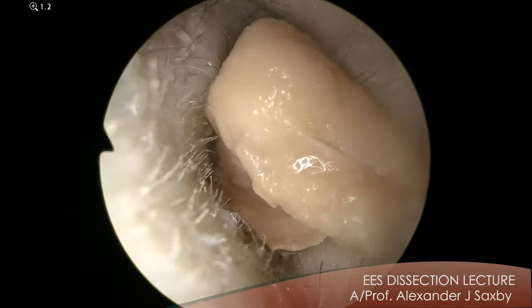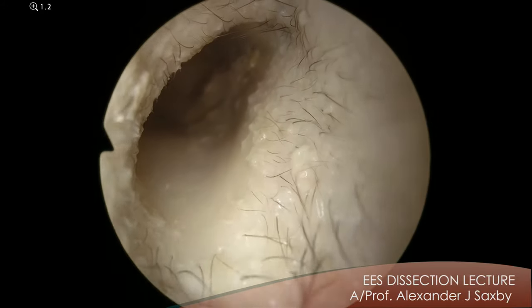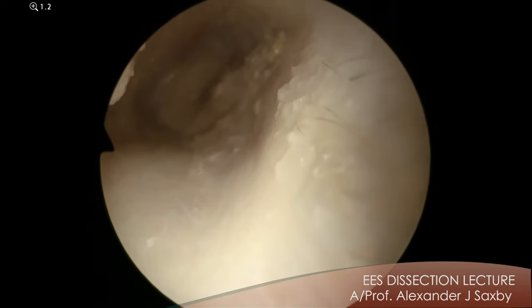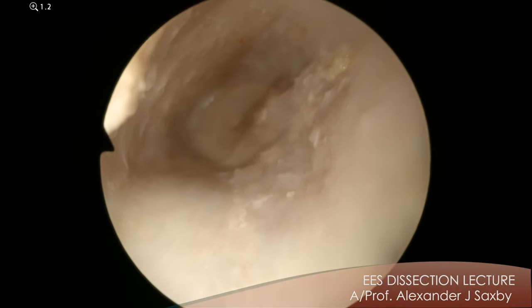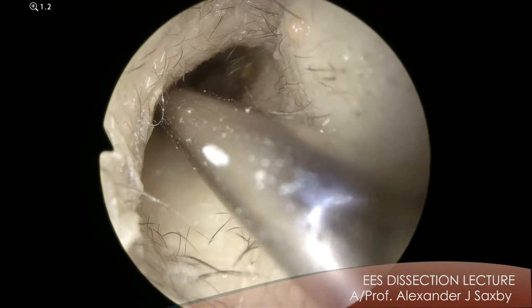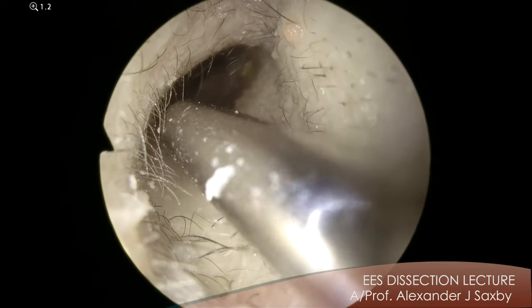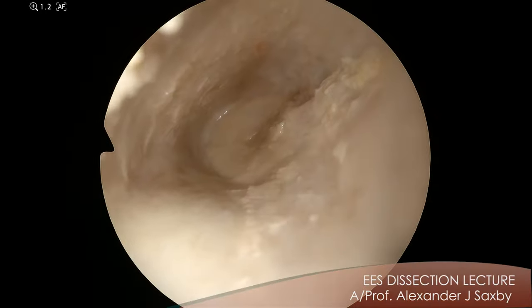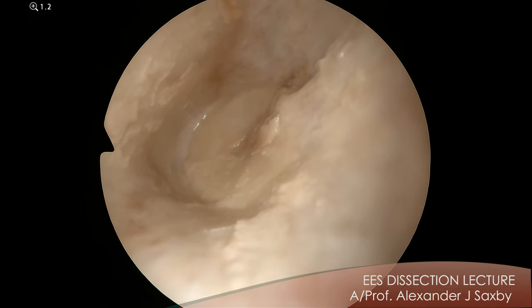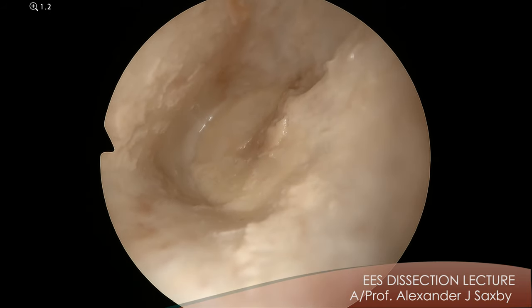Let's hope that's not the eardrum. Good. So we have quite a moderate overhang in this patient. This is a difficult one to do with a microscope. So here we have the eardrum. You can see with the endoscope, you get this amazing view of the anterior recess.